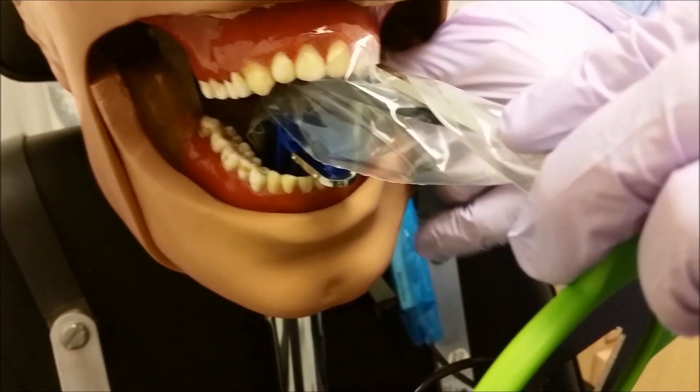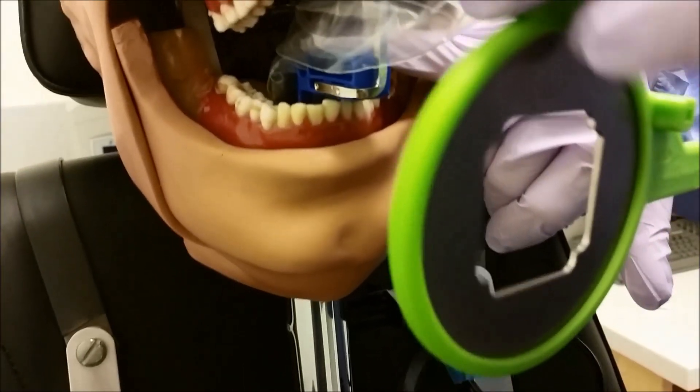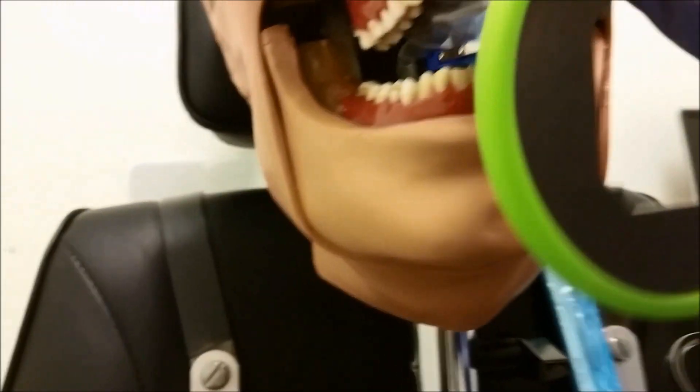Kind of come in a little deep in the mouth. If you need a cotton roll, you can go ahead and place.